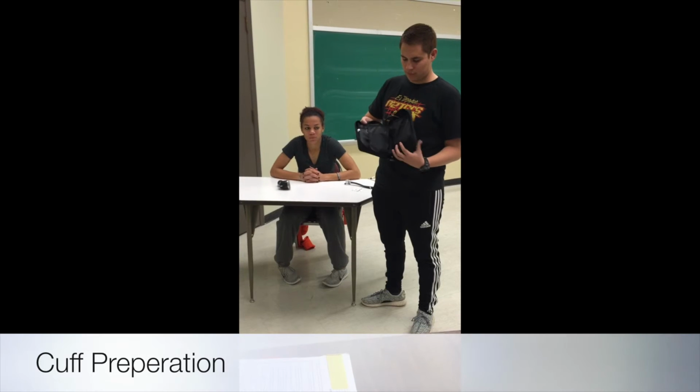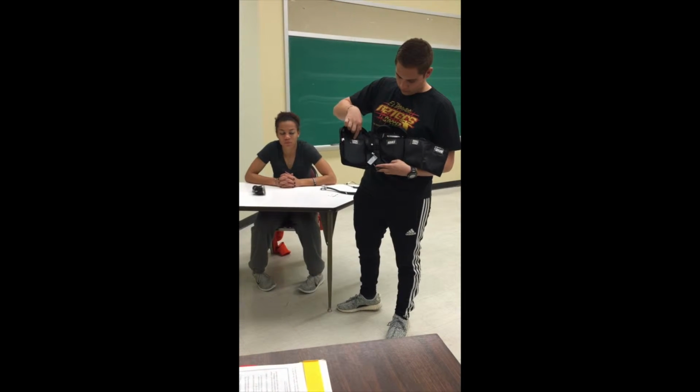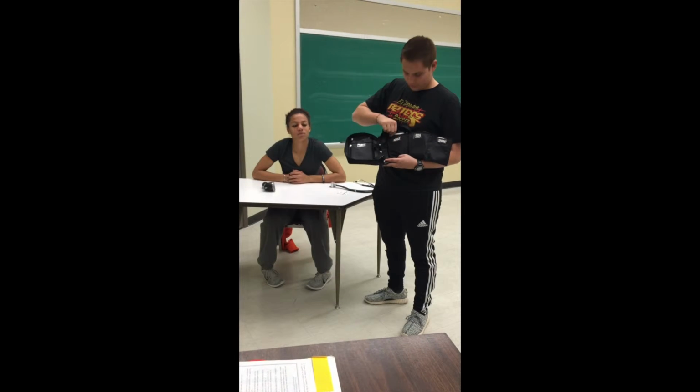Cuffs vary in size. There is small, regular, and adult size. Use the appropriate cuff size according to your patient's arm. In this case, we will use the regular adult size.